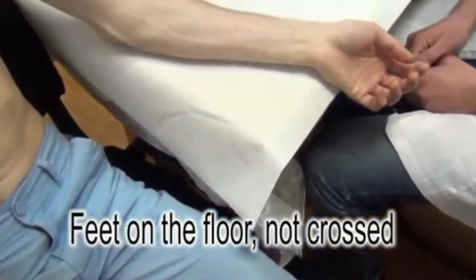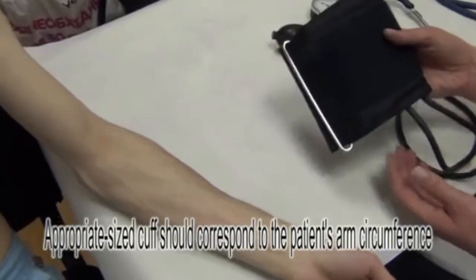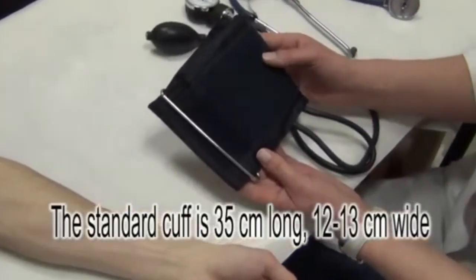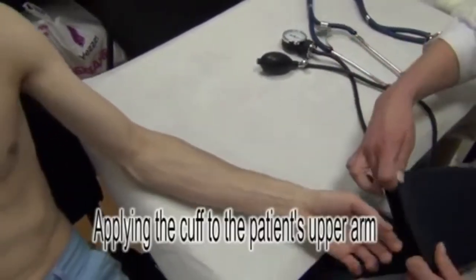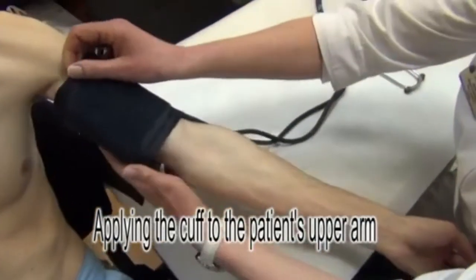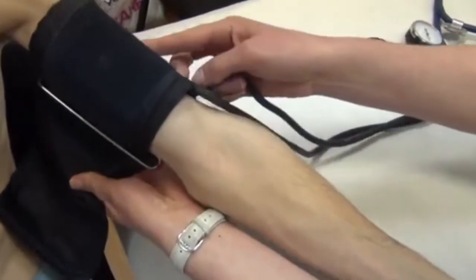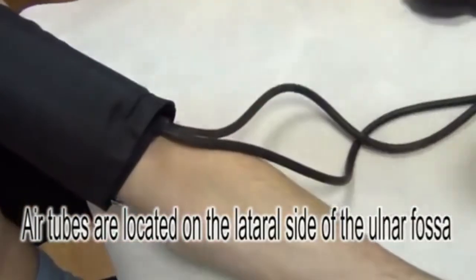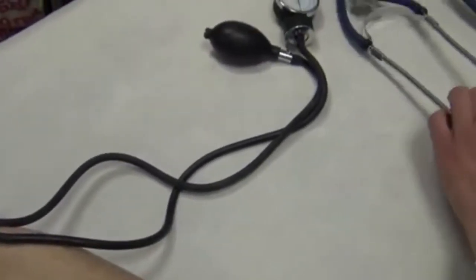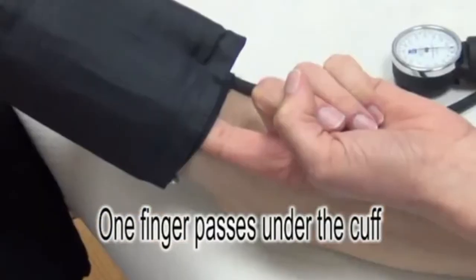Before the blood pressure measurement, we should confirm that the size of the cuff matches the size of the patient's brachium. Typically, a standard cuff is used with a width of 12-13 cm and a length of 35 cm. The cuff is placed around the brachium so that the lower margin is 2 cm above the bend of the elbow. The air tubes of the air reservoir are located on the lateral side of the ulnar fossa and should not interfere with further auscultation. One finger should pass between the cuff and the brachium.